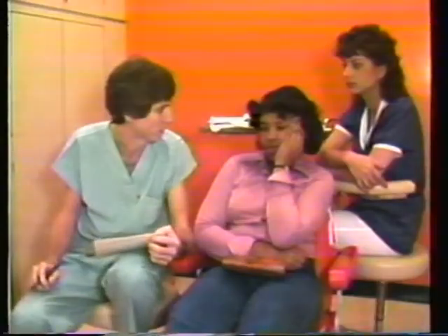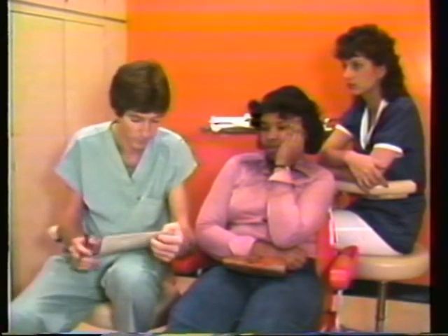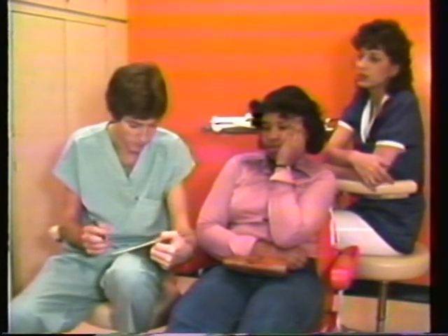The student's manner with the patient is, to say the least, casual, and his choice of words like pulled is not likely to set the patient at ease.